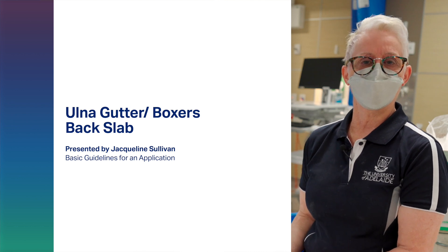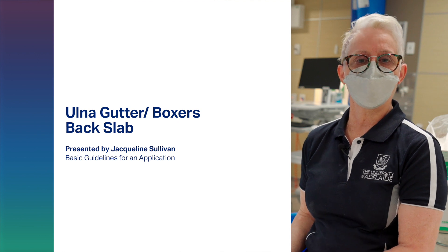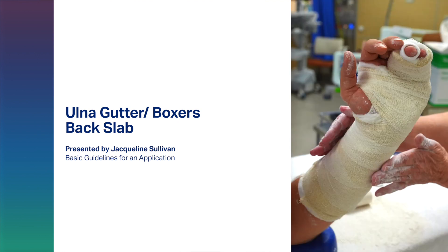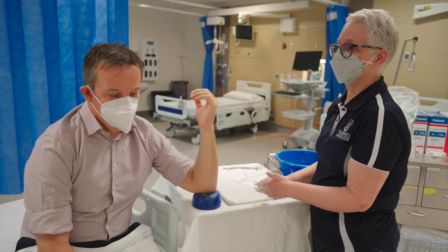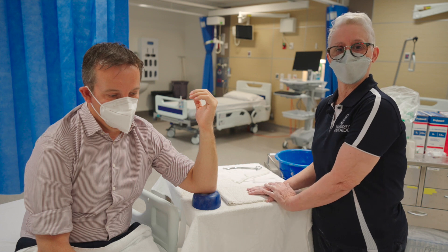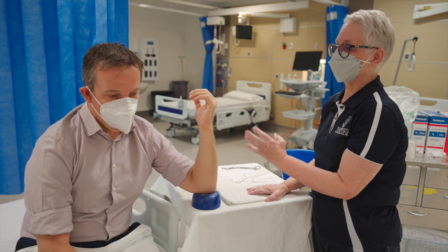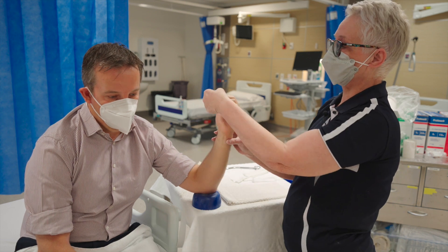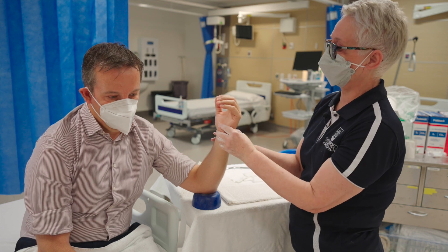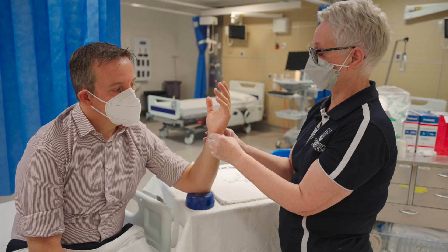Good morning, I'm Jacqueline Sullivan from the University of Adelaide. I'm here to give you guidelines on the application of an ulnar gutter slab. This slab is applied usually for a metacarpal fracture. At the start it's important to make sure you have the right patient and the correct limb. You also need to make sure the skin is intact and neurovascular status is good — check sensation and ask the patient to wiggle their fingers.